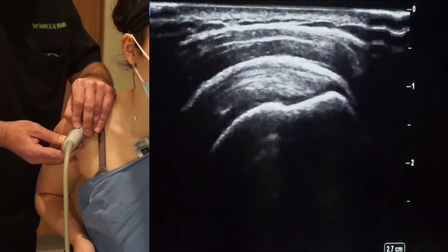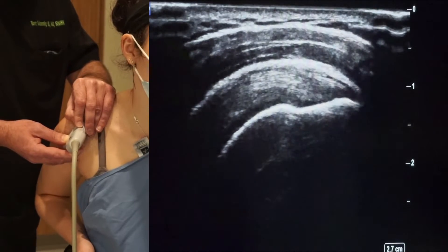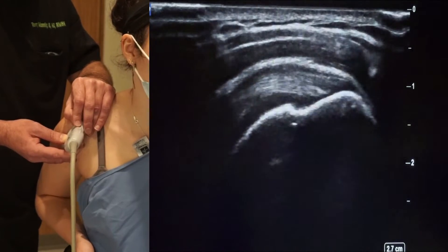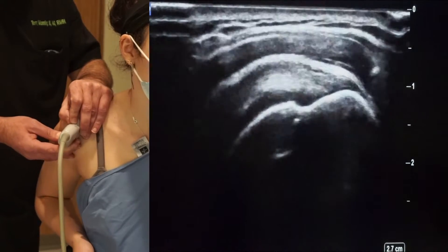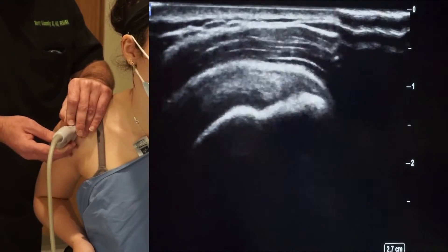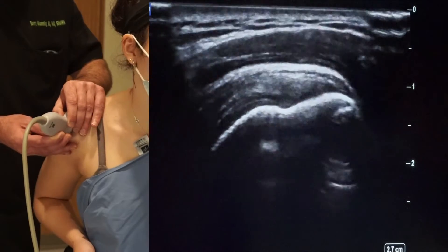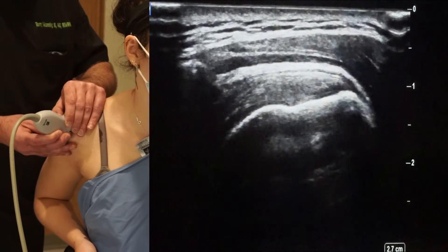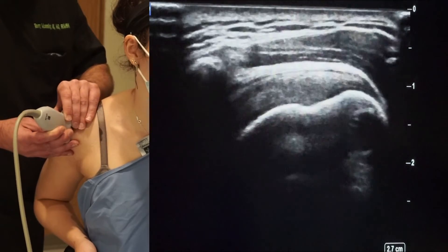When looking at the supraspinatus tendon, this is the most commonly involved rotator cuff tendon with tears — partial tears — but also just plain shoulder pain. The most common underlying cause is supraspinatus tendinosis. As we evaluate the tendon, we're scanning its full width and breadth, and also looking at the subdeltoid bursa over the top — here that's nice and normal with no effusion or significant thickening. Proceeding a little more posterior, the greater tuberosity plateaus and elongates, where the infraspinatus starts to overlap and take over. Here is supraspinatus and here is infraspinatus tendon — intact.